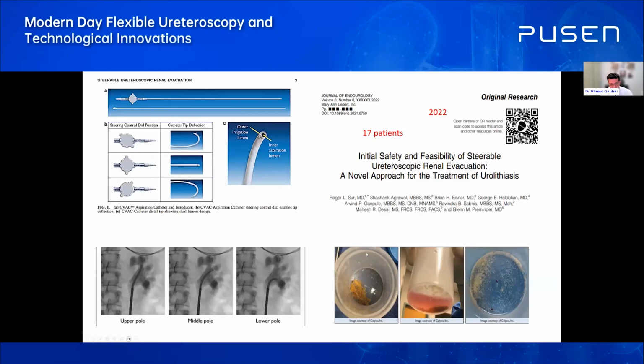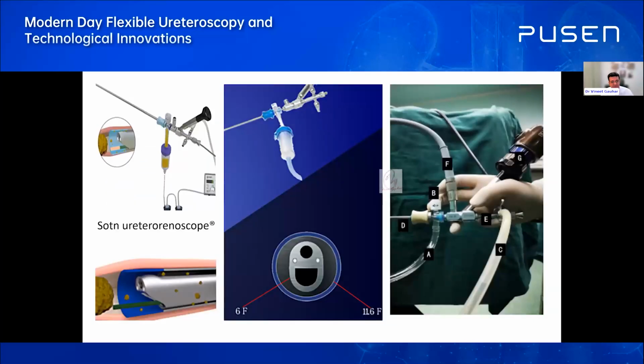There are other things, as you know, different catheters and different everything. Everything is good in your hands if you get used to something. So I'm not saying that what I showed you is the best way, or the best the market has, but all the suction technologies are definitely improving stone-free rates. So much so that they started introducing them into semi-rigid scopes as well. Ureteric stones have become easy to do. This is a brilliant thing that we were studying. It's really interesting. It works very well.